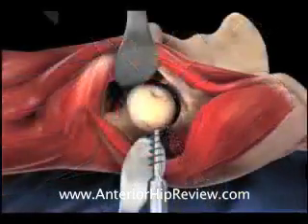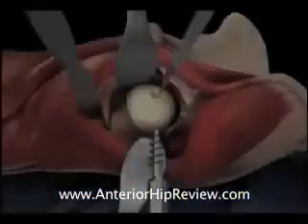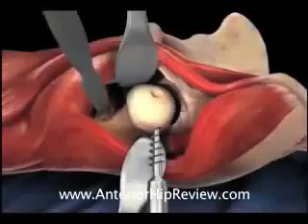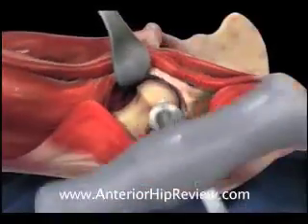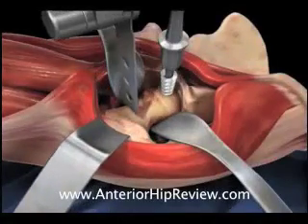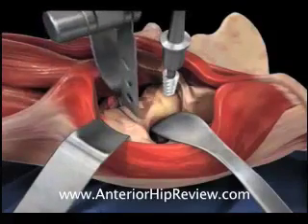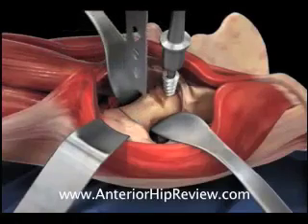Once the head and neck have been appropriately exposed, the capsular release is completed, and an oscillating saw is brought into the surgical field in order to remove the diseased and arthritic femoral head. Here is an illustration of the oscillating saw making the neck cut in the proximal portion of the femur. The power corkscrew in the femoral head is then used to lever the femoral head out of the acetabulum.